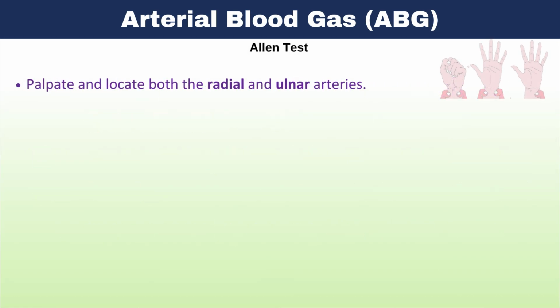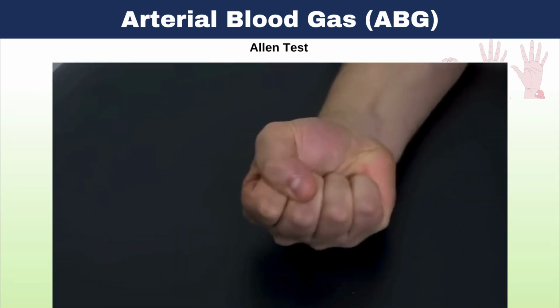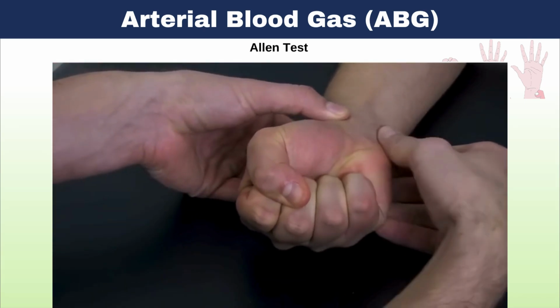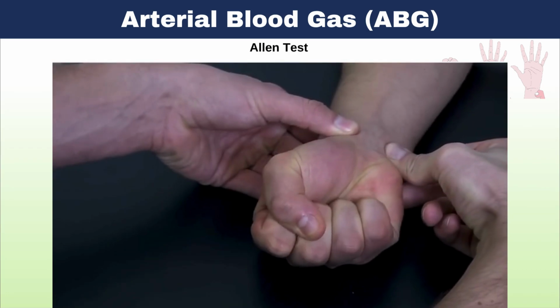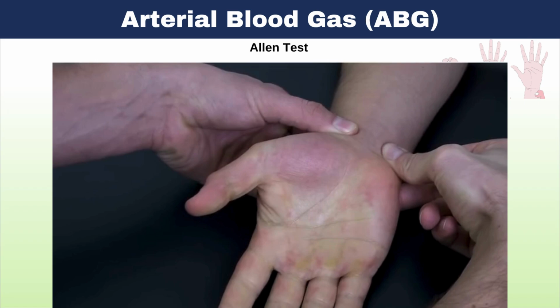Let's see how it works. First, palpate and locate both the radial and ulnar arteries. Ask the patient to make a fist tightly and elevate the hand by flexing from the elbow. Alternatively, the patient can close and open the fist a couple of times to increase blood drainage from the hand. Next, compress the ulnar artery and radial artery simultaneously with the thumb or fingers. The patient is then asked to open and relax his or her hand, which should appear whitish and blanched.